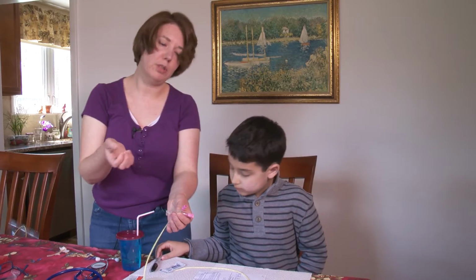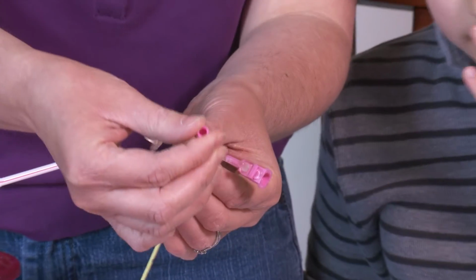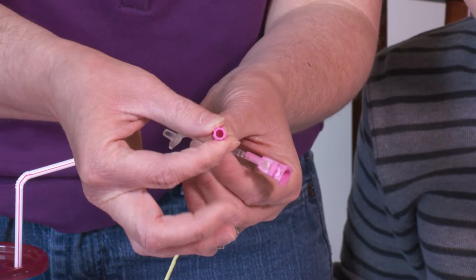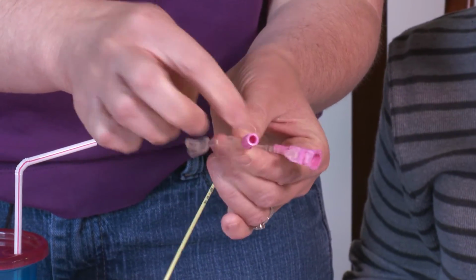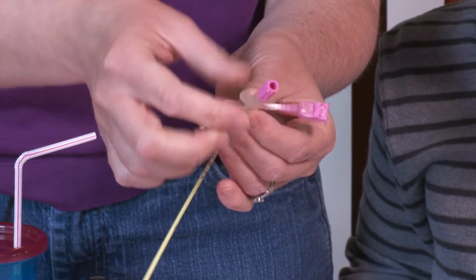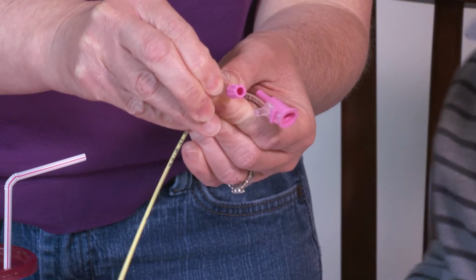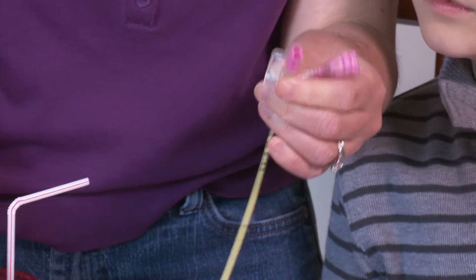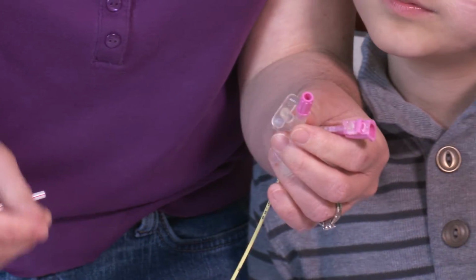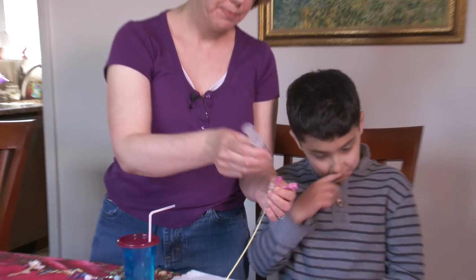Some people don't use the guide wire, but we found that for us it works better to use it. But you're going to make sure that it wiggles. You don't want one that's stuck in the tube. All right, and then make sure you put the cap so that it's not moving while you're putting the tube. And make sure you cap your med port, because otherwise stuff will be coming out the med port while you're doing stuff. All right, so what you need is a syringe with just a little bit of water in it.